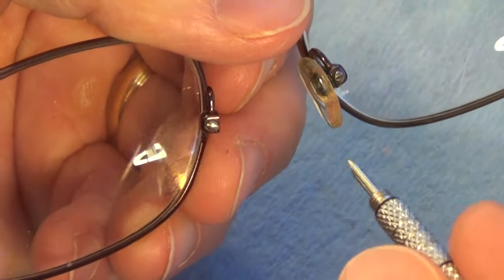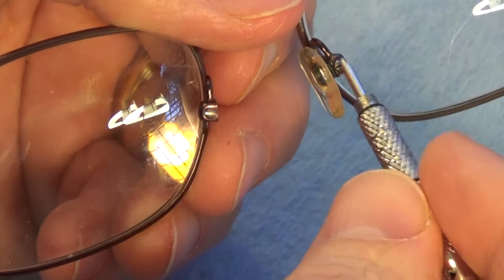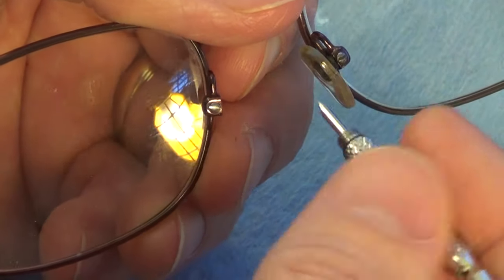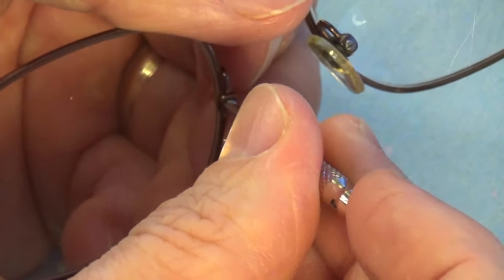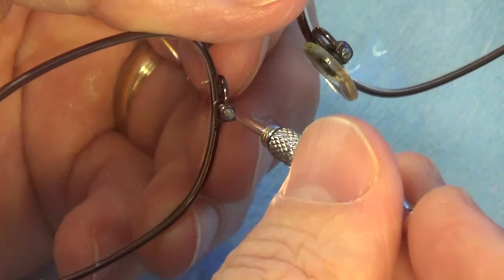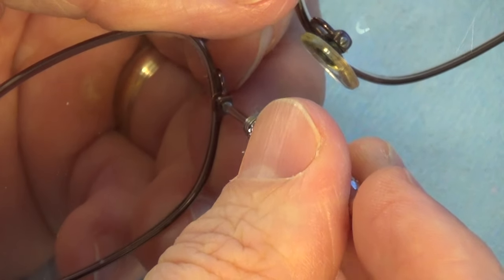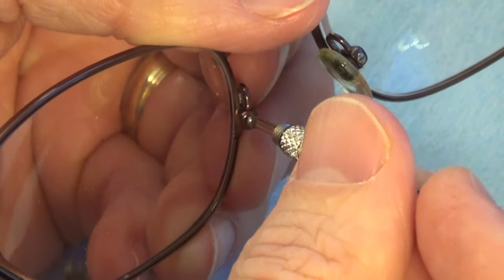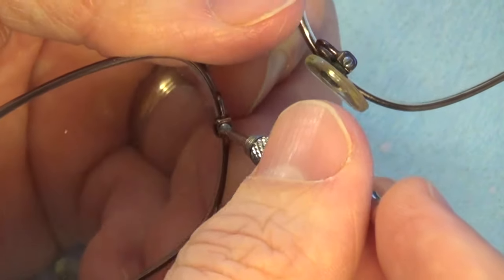I'll use the screwdriver from the kit to remove the screw on the side where the pad fell off, and then remove the screw on the other side to remove the remaining pad. These are very small screws, so if you have trouble seeing them you may need some help — I'm struggling a little bit myself.